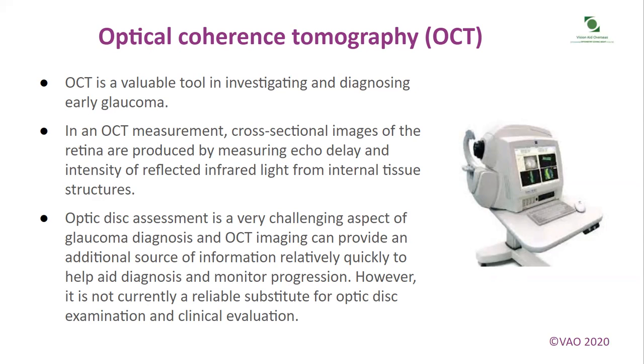Optic disc assessment is a very challenging aspect of glaucoma diagnosis, and OCT imaging can provide an additional source of information relatively quickly to help aid diagnosis and monitor progression. However, it is not currently a reliable substitute for optic disc examination and clinical evaluation, and is not available in all settings.